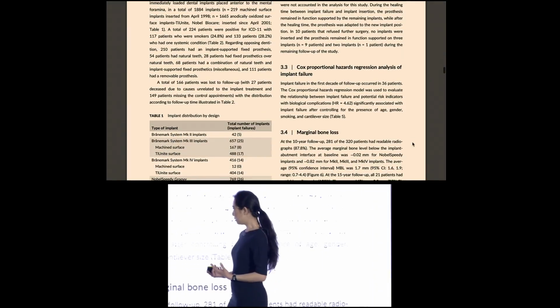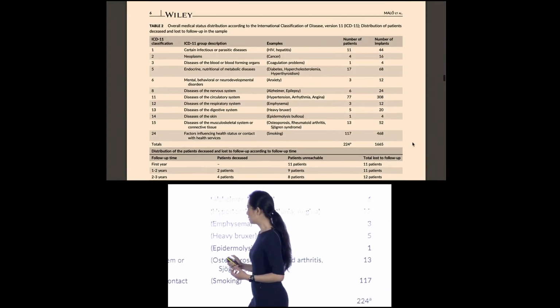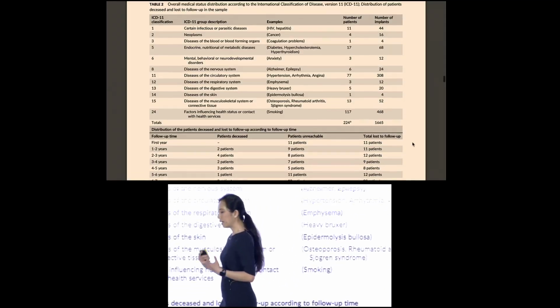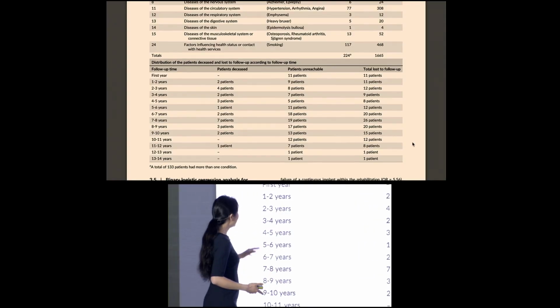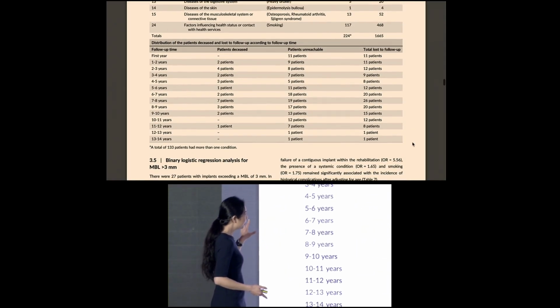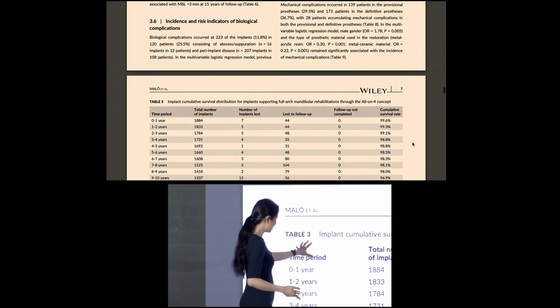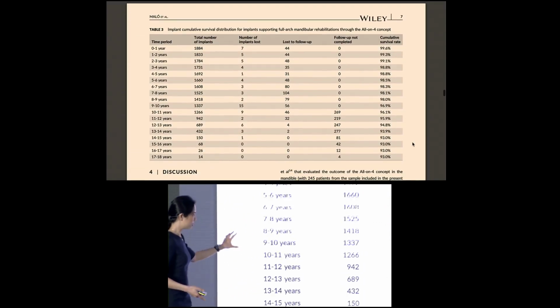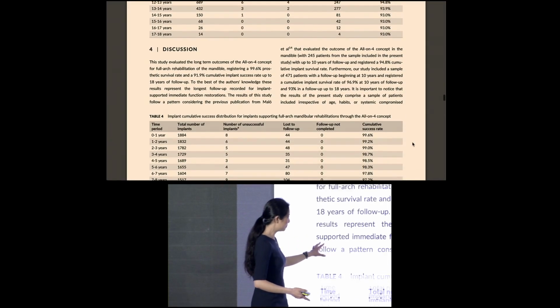However, what you'll see here is that regardless of the type of implant placed, where the implants are placed, they had a full workflow dialed in so that you would see that maybe the surgeries went consistently and the restorations were also inserted a certain way and very consistently designed a certain way because they're all from the same labs.